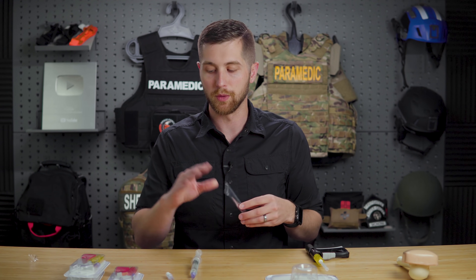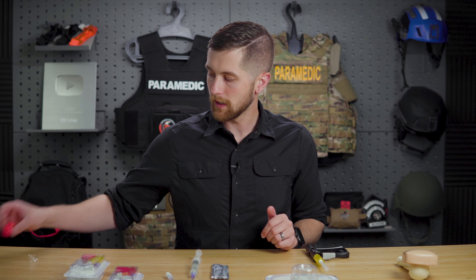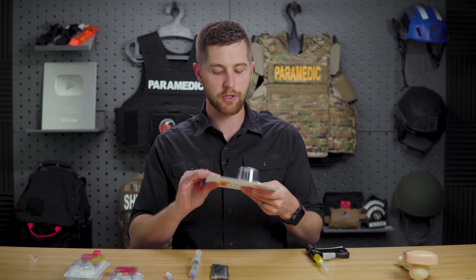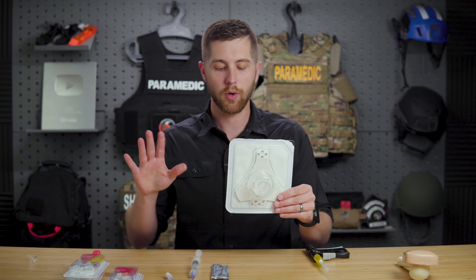Make sure you're cleaning the site well before insertion — we don't want to worsen the patient with infection. You'll also want a sharps container. Finally, you need some way to secure the IO in place. I have the commercial securing device from SAM, but if you don't have one, you can use bulky dressings on either side and tape them down. The best thing you can do is make sure people know it's there and protect it at all costs, as these needles stick straight out and are easy to hit, bend, or dislodge.